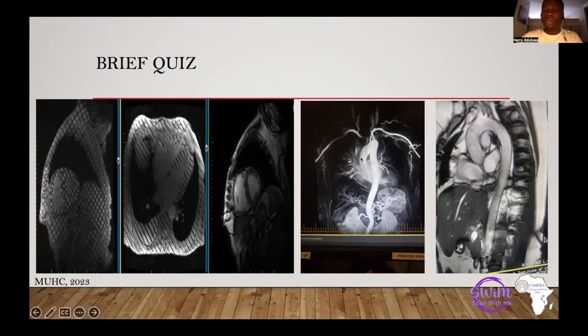And this one is just one of the sequences under portal vein. Don't mind the imaging, it is just a single sequence post-contrast imaging. And then this one is just the basic assignment I gave you earlier, where you help me cut through perpendicularly across the arc of the aorta, ascending and descending. Try this on your system and let me know.